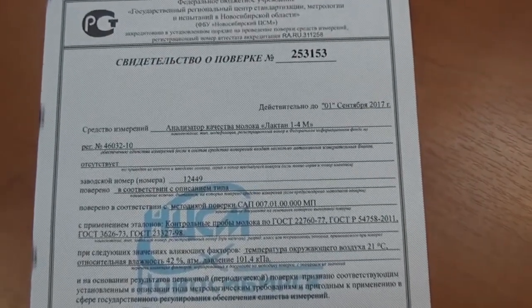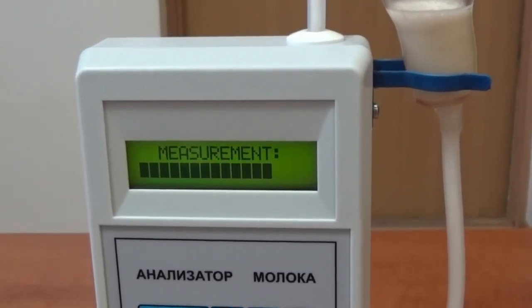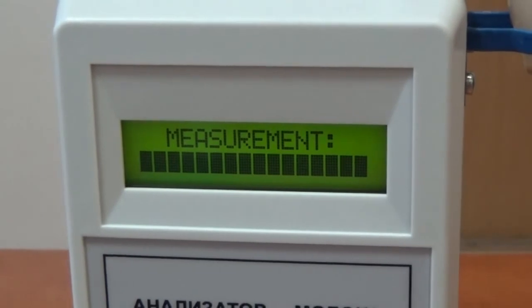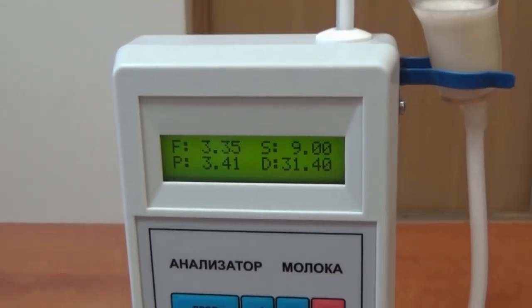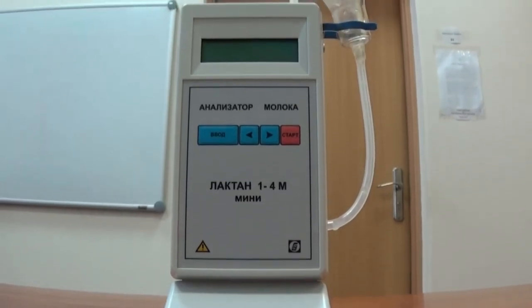The manufacturer's warranty for our analyzer is one year. Currently, Lactan Mini is the most economical and affordable model in the Russian and foreign markets, combining user-friendliness, reliability, flexibility, and excellent accuracy and repeatability.